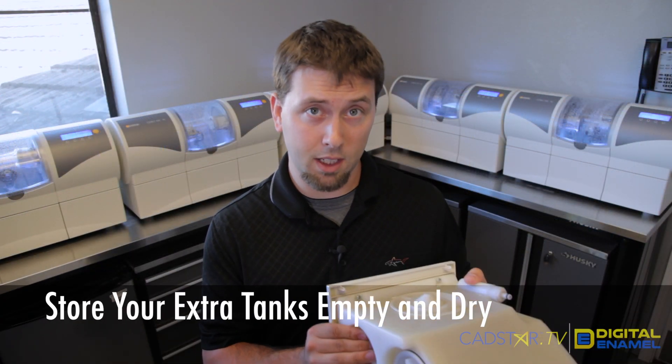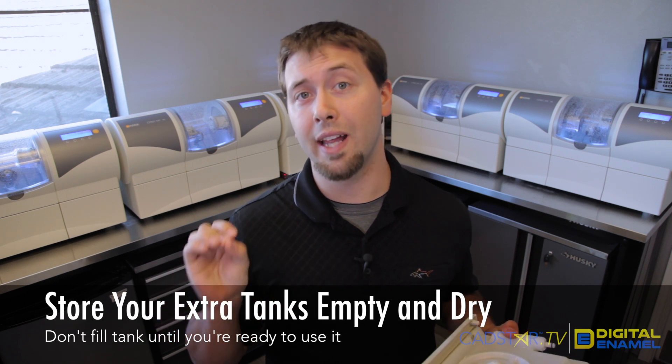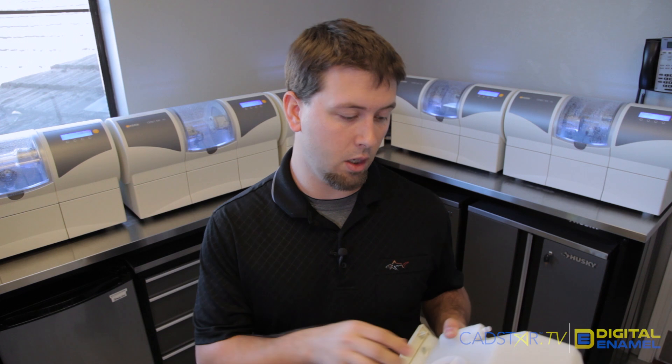If you're not going to use the tank immediately, let it dry out. Sirona doesn't want you to let it sit for longer than a week if it's not being used, so don't fill it until you're ready to use it.